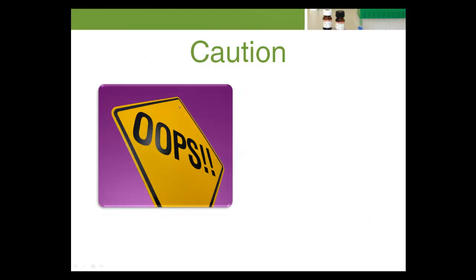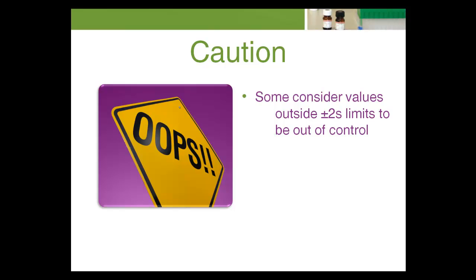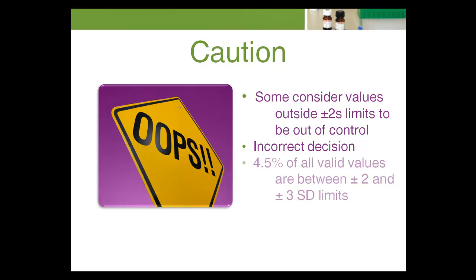Some laboratories consider any quality control value outside its positive-negative 2s limits to be out of control. They incorrectly decide that the patient's specimens and QC values are invalid. An analytical run should not be rejected if a single quality control value is outside the positive-negative 2s QC limits but within the positive-negative 3s QC limits. Approximately 4.5% of all valid QC values will fall somewhere between positive-negative 2s and positive-negative 3 standard deviation limits. Laboratories that use a positive-negative 2s limit frequently reject good runs, meaning patient samples are repeated unnecessarily, labor and materials are wasted, and patient results are unnecessarily delayed.